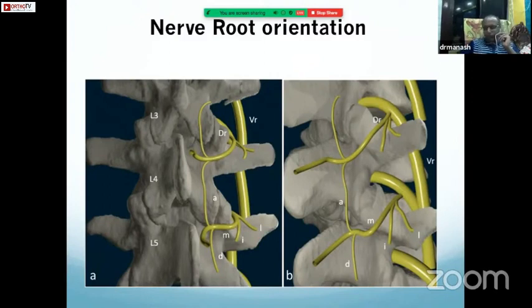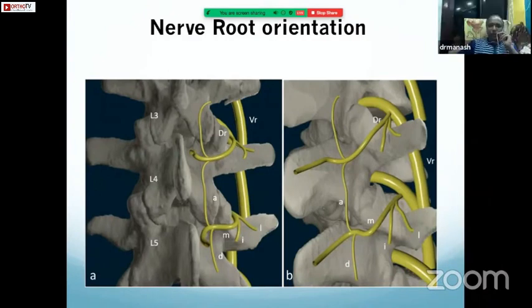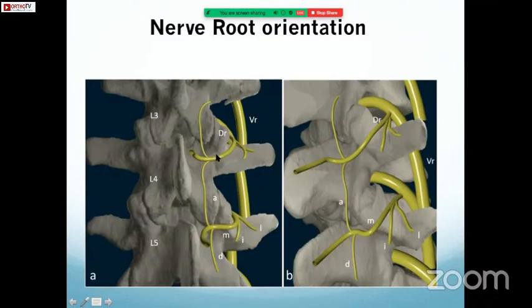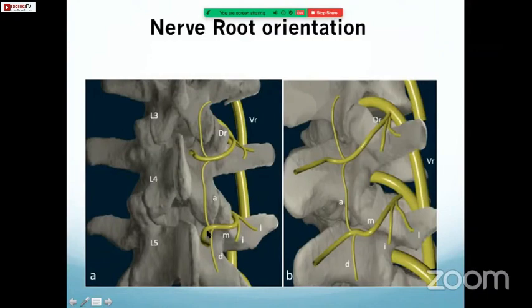As you see, the facet joint injections, when you do them for local injections, many a times they recur. So this is the recapitulation of the anatomy. Our main target is the medial branch of the dorsal rami, and there are components from the above and one level up.